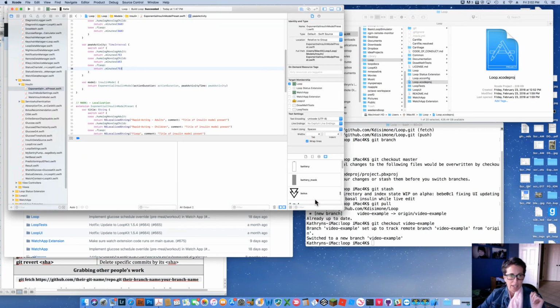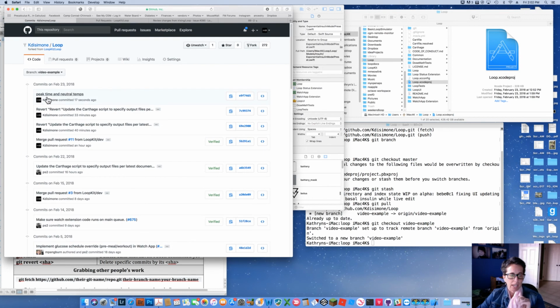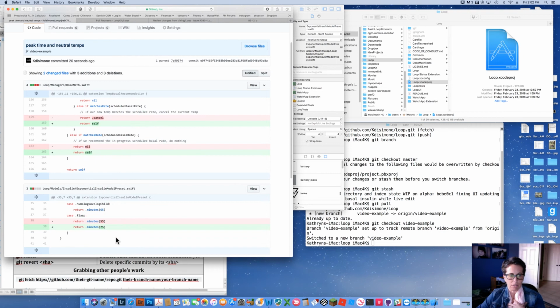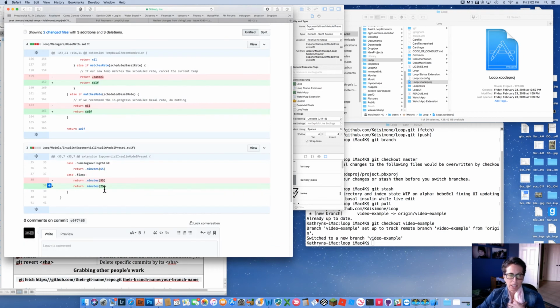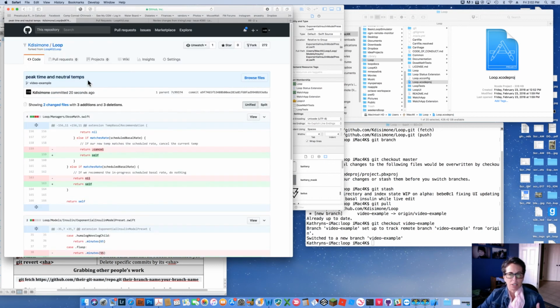So I do that. My M's disappear because now they're committed. Everything's updated over here. And also online, my video example now has a new commit, and it'll show me exactly which lines changed on what files. The green means that's what it is now. The red means that's what was changed. So I can see exactly what each of those commits were.